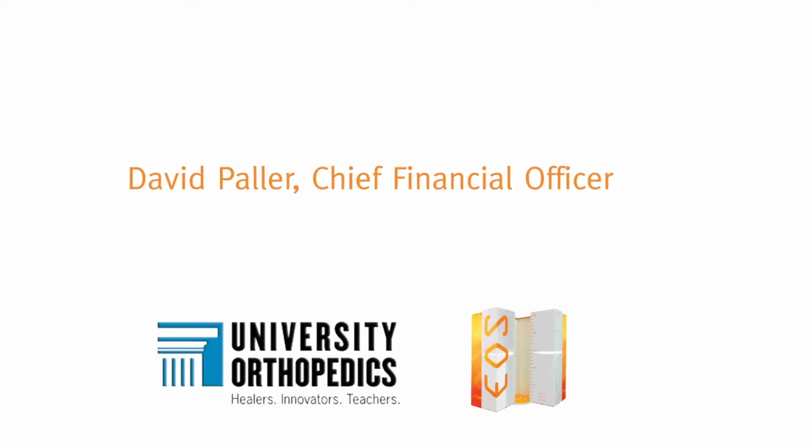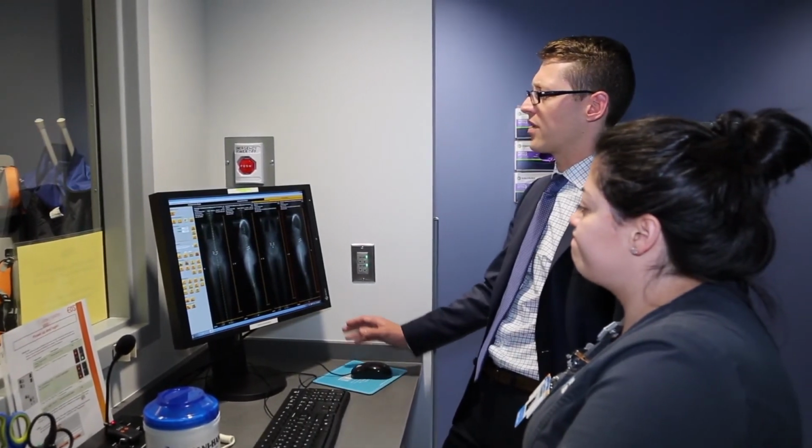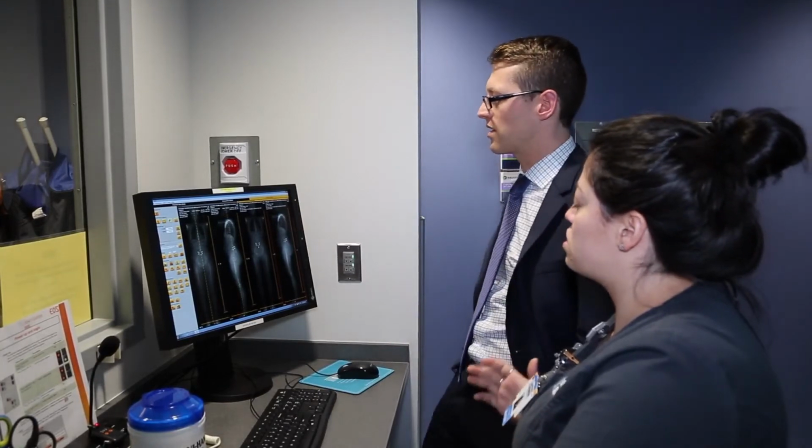On the management team, we're not on the clinical side, so we're not even cognizant of these types of technologies. The physicians would bring proposals to us, and then we'd collaborate with, say, EOS in this instance, where we learn a little bit more about the cost benefits of the technology. Being that it's an advanced imaging technology, it's more expensive than, say, a traditional DR, but there still are added benefits to utilizing this technology, and so we have to understand those benefits and basically do fiscal forecasting to see if we can make it work.